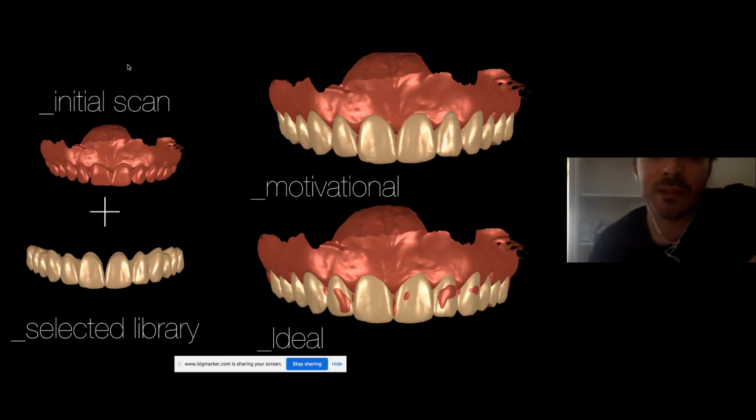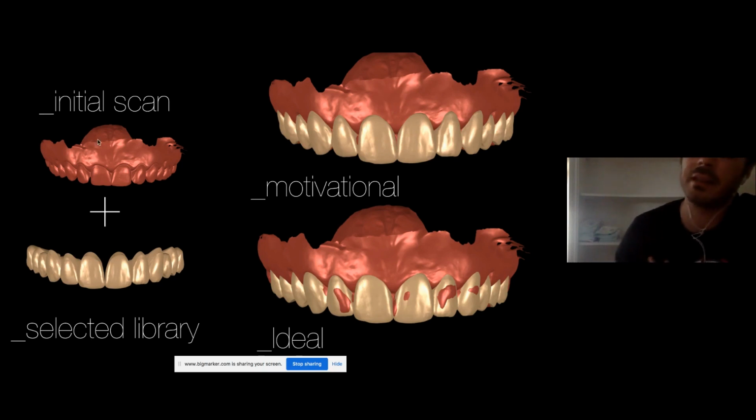And normally, step one, what is the first thing you need in a case? You need consent, right? The patient to accept, correct? Yes, indeed. So actually, that's the easiest and the fastest way.